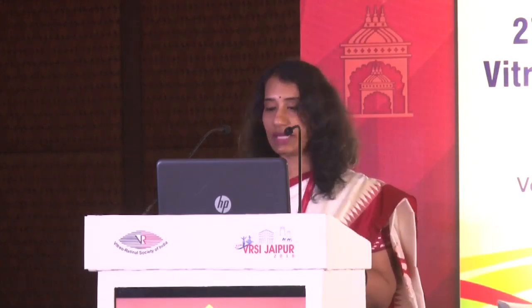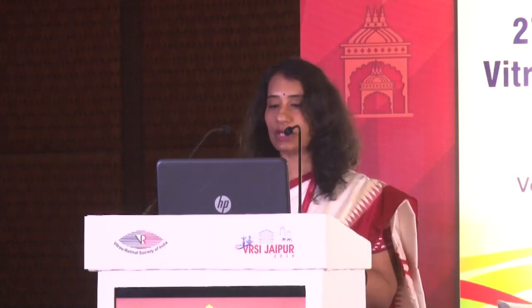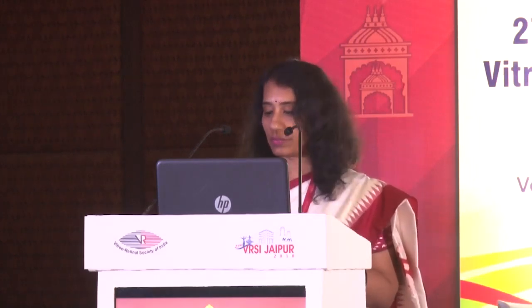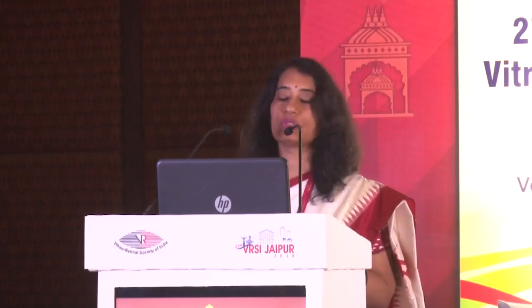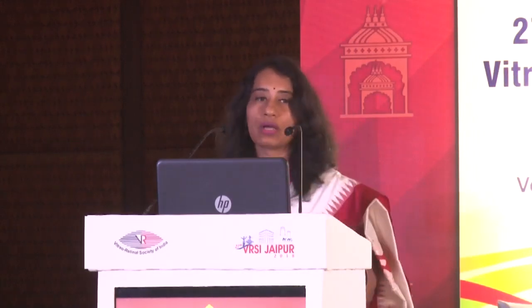And in AZOOR, actually, multifocal ERG corresponds to the field abnormalities as well, as you can see in this case. Corresponding to the field abnormalities, the multifocal ERG also is very much reduced. So we have several applications of ERG, and it's really been a game changer in the way we manage retinal disorders. So thank you very much for your time.